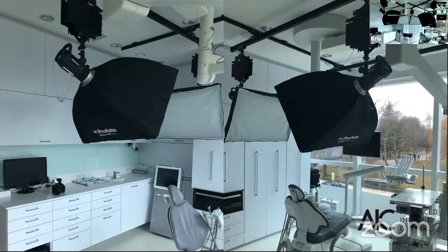This is one of the setups in one of my rooms, where you see the setup for photography, which is like a studio. So more or less, this is a rail system, where you see studio flashes connected with soft boxes.